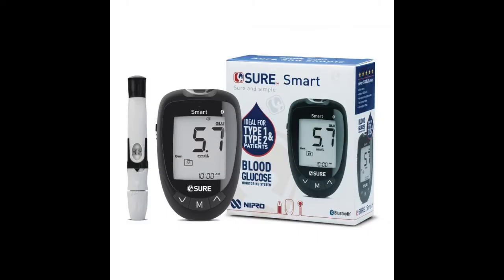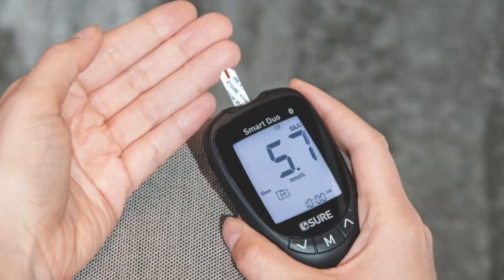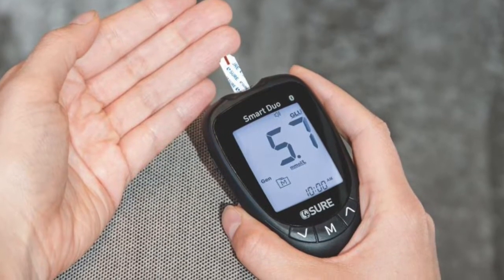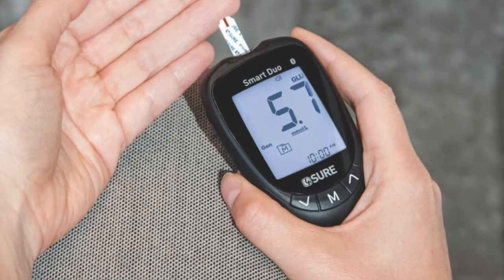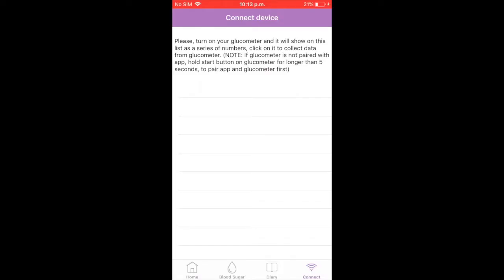Before Rose can go any further, Mary has to provide Rose with a fresh glucometer kit that she can use at home to test her blood sugar levels with. Mary shows Rose how to take a reading and mark this reading as either fasting or post-meal on the glucometer. Mary then shows Rose how to connect the glucometer to the GDMApp by going to the Connect page and holding down the big button on the glucometer until the Bluetooth is activated. This causes the glucometer ID to display on the Connect page.